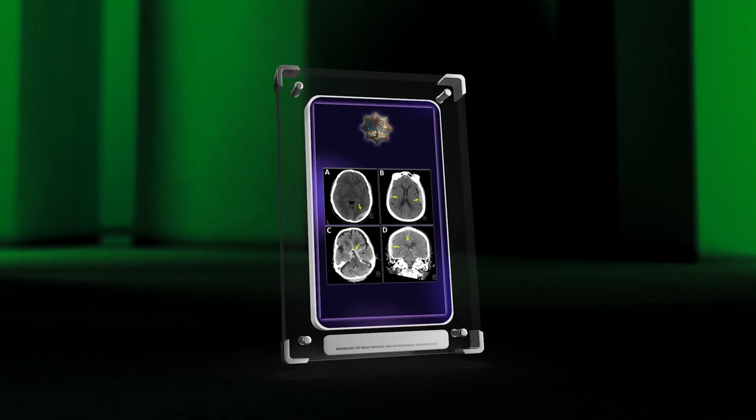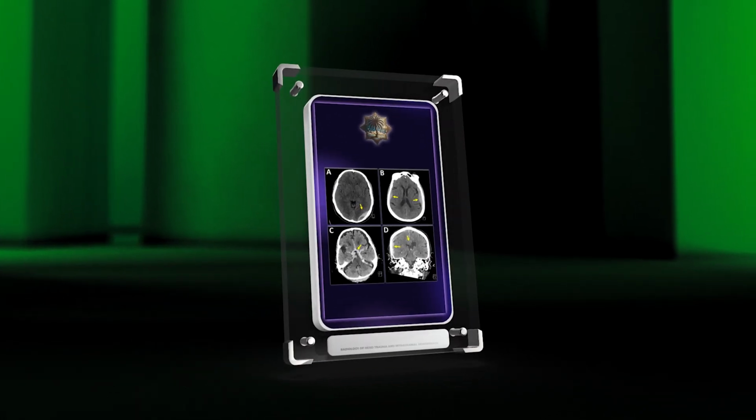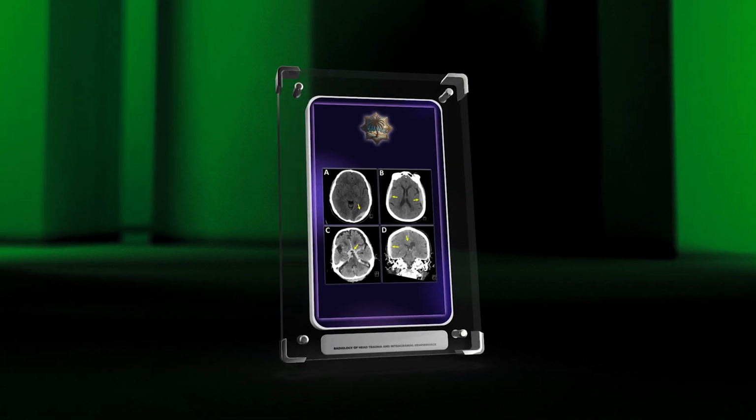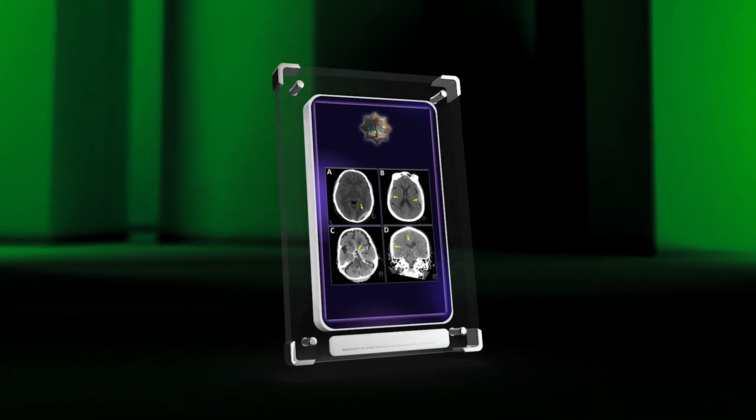To effectively diagnose and manage head trauma and intracranial hemorrhage, it is crucial to comprehend the radiological aspects. Knowledge of different pathologies and imaging techniques is vital for patient care and advancements in this field.